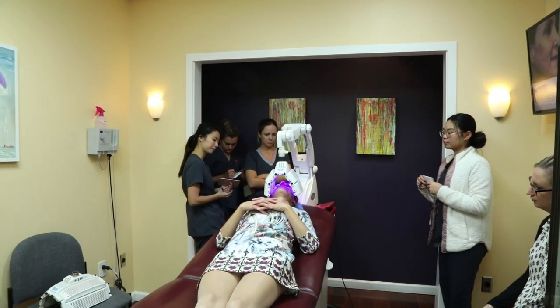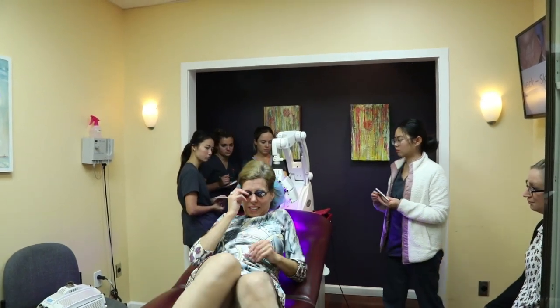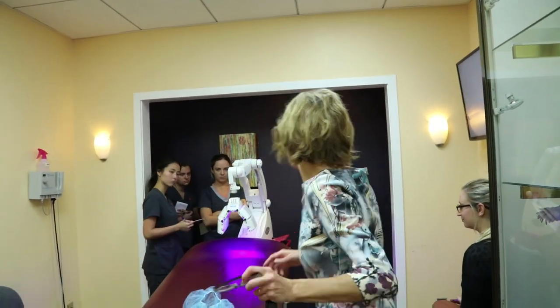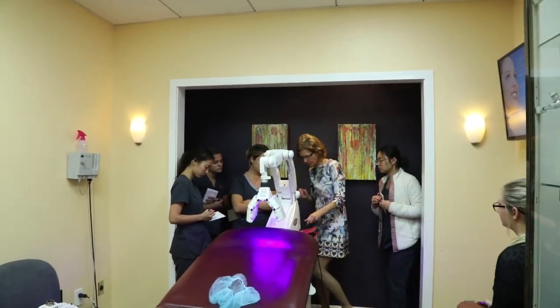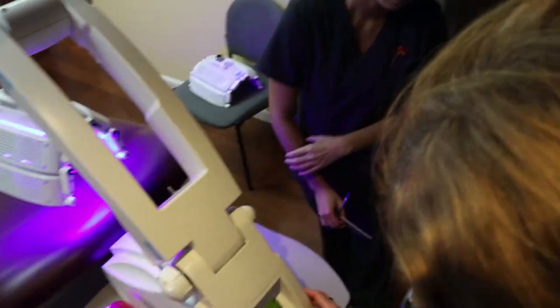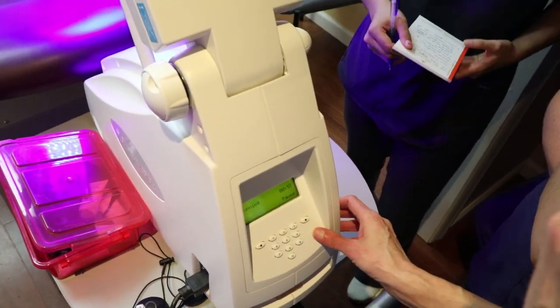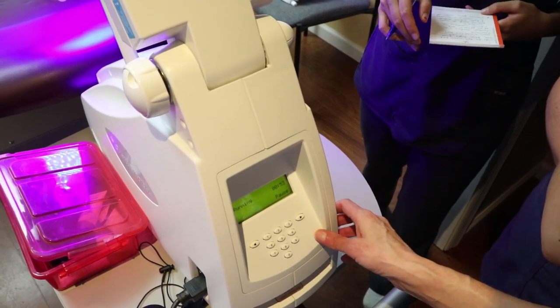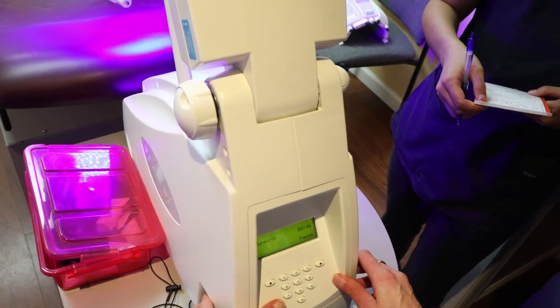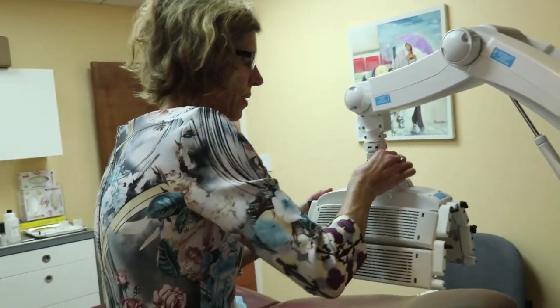Once your two minutes have elapsed, you don't remove the patient — you leave the patient there. But you're going to have to switch the filter. You can turn it off, then unlock the thing, unscrew the top portion, and change to the red light filter.